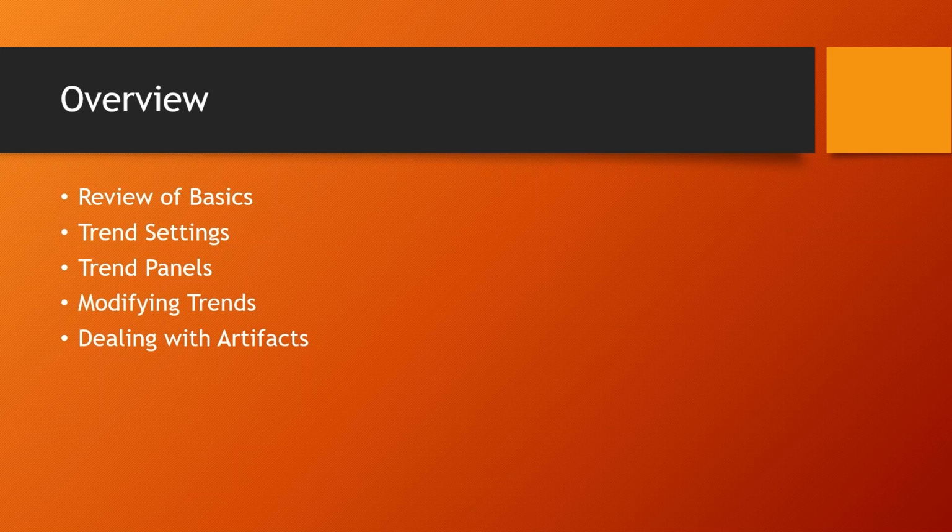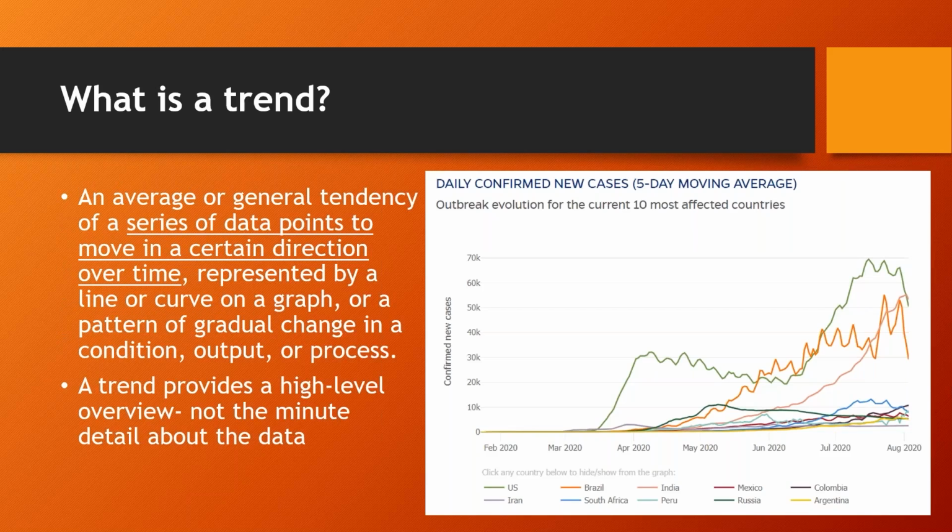That's obviously the bane of any trending graph that doesn't give you the detail. So we of course have to get to the detail there. So we'll start with a review of what we covered last week, and I'll go through these rather quickly.